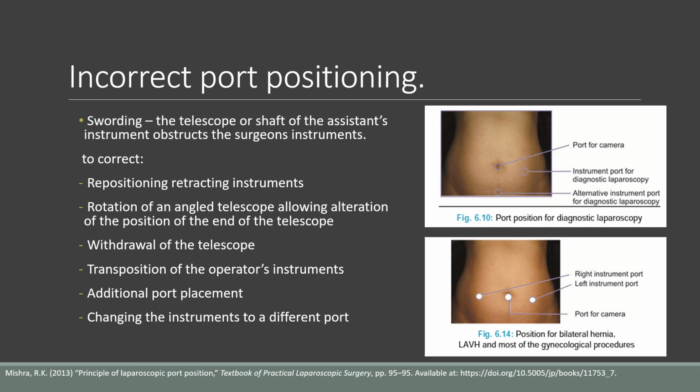For example, on the right hand side, I've put up two pictures of the different laparoscopic port placement sites for different procedures. On the top we have port position for a diagnostic laparoscopy, and then on the bottom you can see how the port placement differs if you were going to do a procedure for a bilateral hernia, LAVH, or for most gynecological procedures. So that's something to bear in mind when you are thinking of laparoscopic ports and their placement.